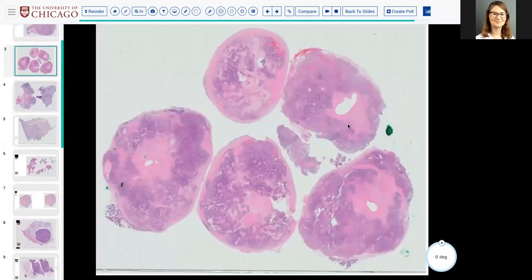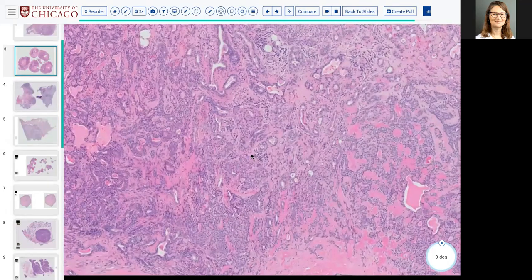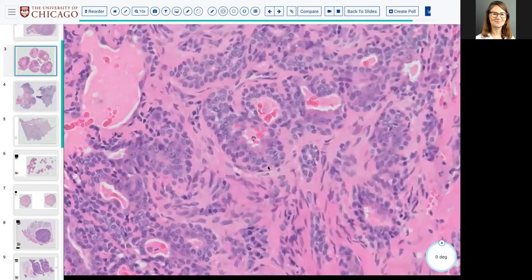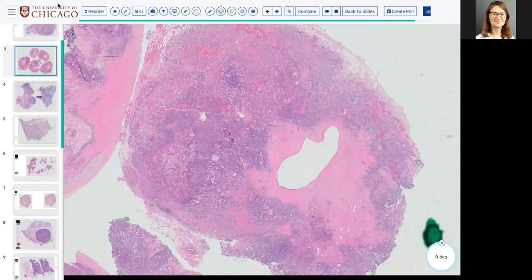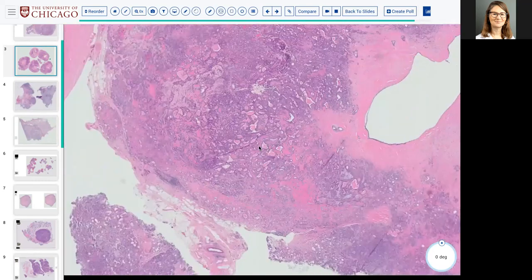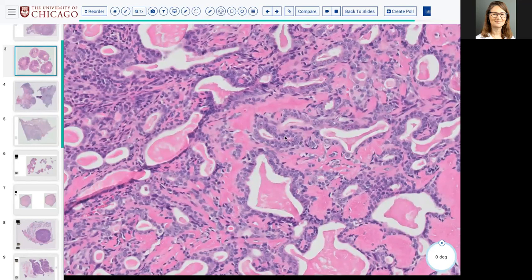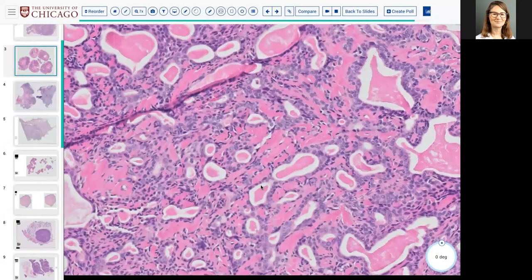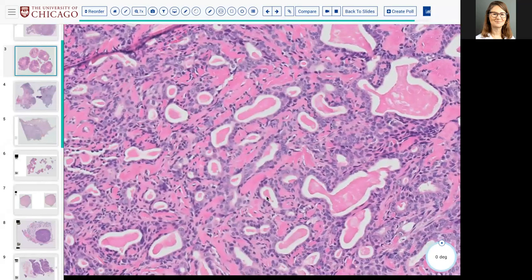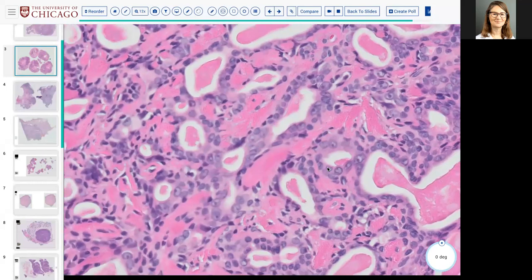And so as we look through this one, what are the two stains that those of you who've signed out with me often use to highlight the two morphologic cell types, whether it be PA or other? Like c-KIT and P40. Yeah, exactly. So CD117 or c-KIT tends to highlight the epithelial component, not only of adenoid cystic, right, but also of things like pleomorphic adenoma and basal cell adenoma, and P40 highlights the myoepithelial cell population in pleomorphic adenoma, basal cell neoplasms, adenoid cystic, all of the above. So the presence of c-KIT/P40 is not definitively diagnostic of a specific tumor type, right? But it's diagnostic of how many cell types are present. And arguably, you can see even in this second example, these smaller myoepithelial cells around these more plump duct-like cells.